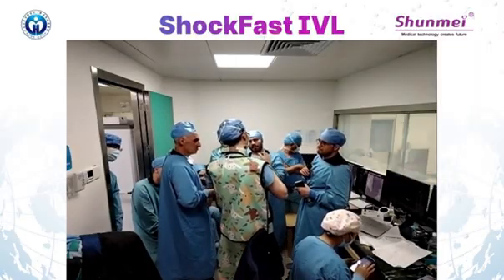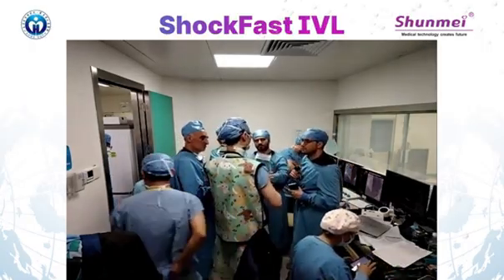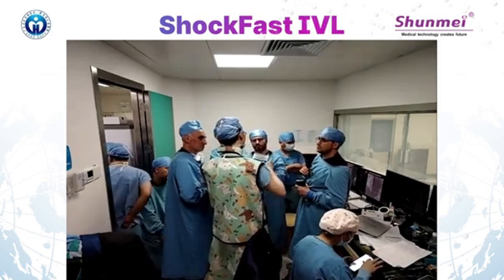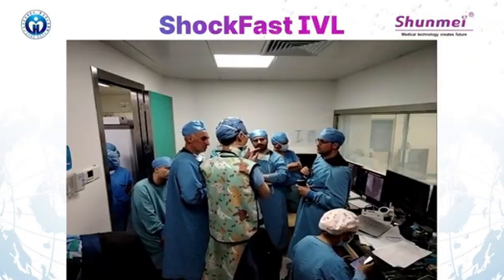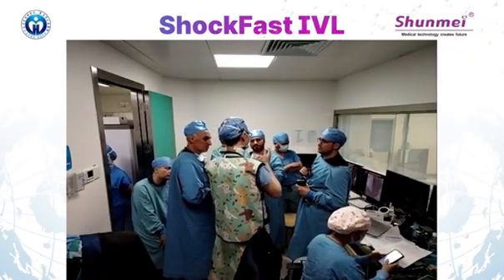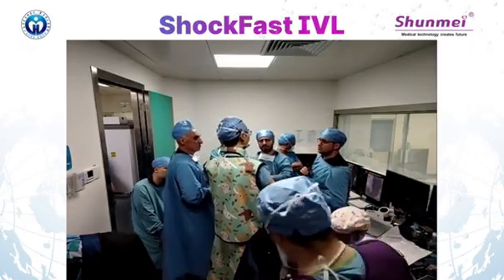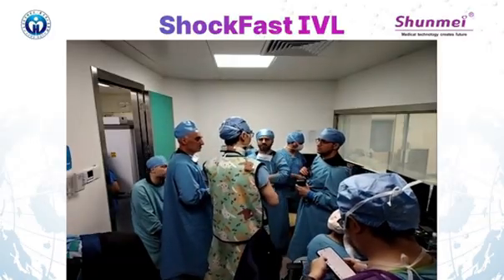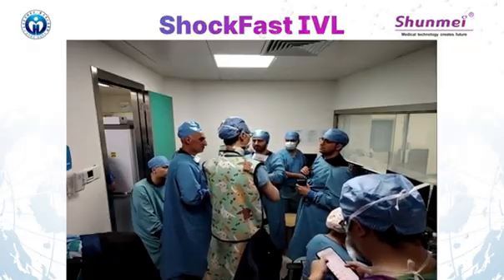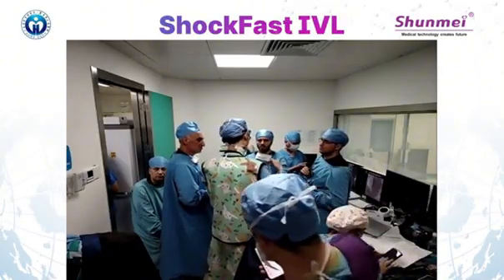The reference diameter for me is 3.0, absolutely at least 3.0, but because it's very narrow and very bent, I try my best to use a small balloon, whether non-compliant or IVL balloon. I use the small one. At first, I need to get across.